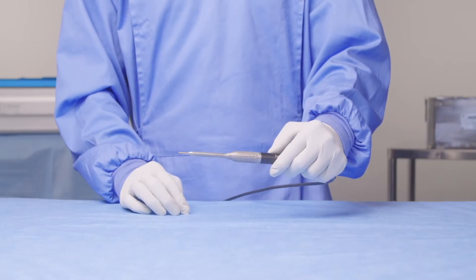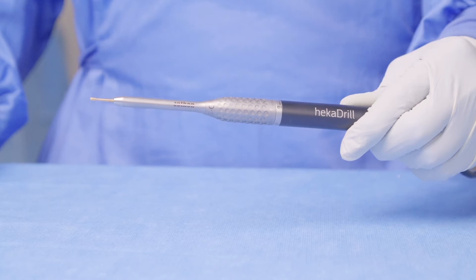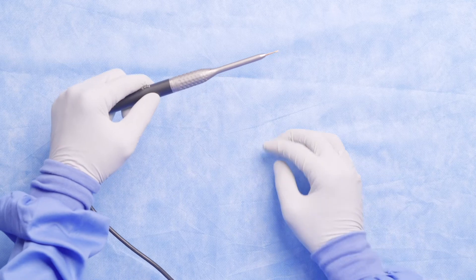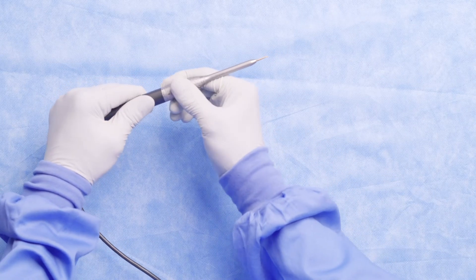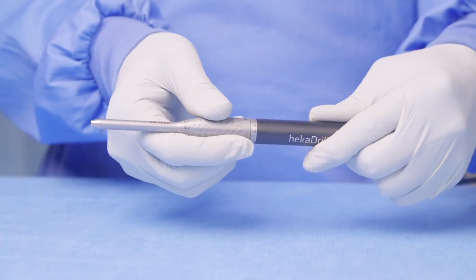You can then press your foot pedal to activate the system. Once finished with the burr, you can twist the locking mechanism back to the unlocked position, slide the burr out, and then remove the whole attachment.